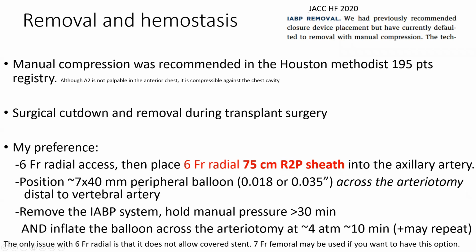So we position that balloon, then we remove the balloon pump system, and we hold manual pressure for over 30 minutes. So we're doing hemostasis using 2 techniques. We're using the manual pressure, but we're also using balloon inflation. Typically, you take the balloon pump out while the peripheral balloon is ready to be inflated, and you immediately inflate the balloon as the balloon pump is out, and you're holding manual pressure.